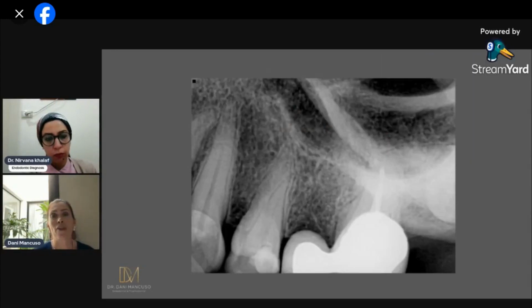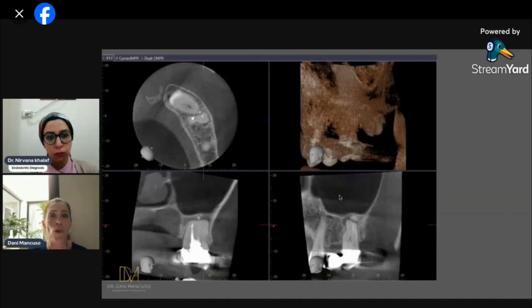Same thing when you have impacted molars, a wisdom tooth in front of the second molar, for example, or the premolar, or an impacted canine over the apex. All of those cases get a bit more complicated, and the CBCT can show you more of the anatomy of that tooth, for example the untreated canal, where the radiolucency is, the curvature, and all of that for you to plan your case.